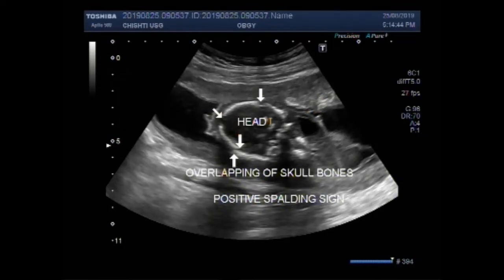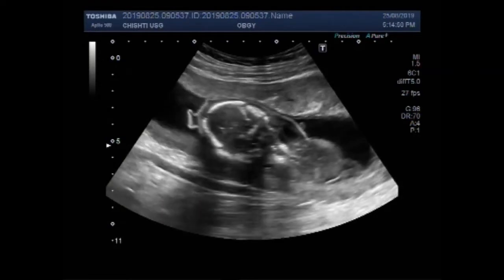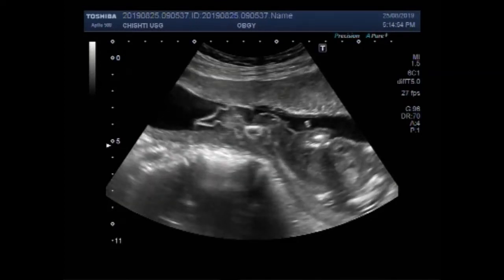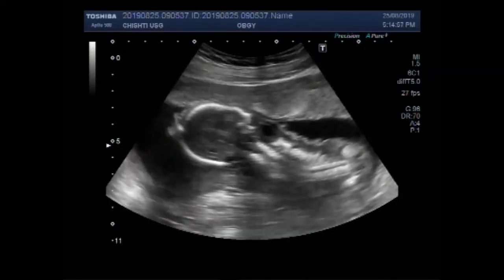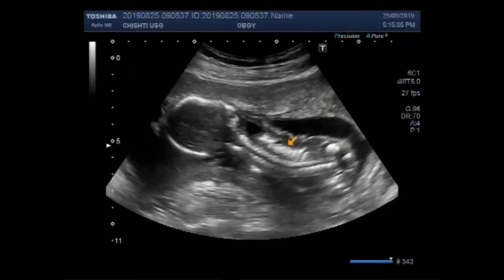This is the fetal head. You can see the fetal abdomen and spine. And this is the spine of the fetus.